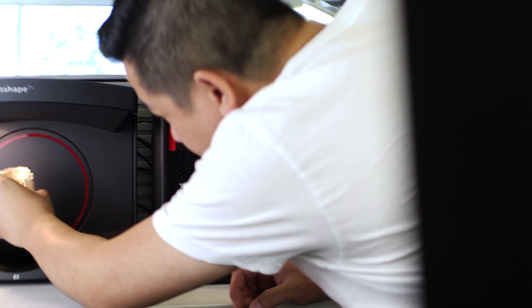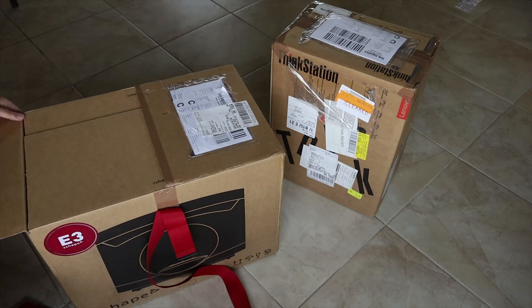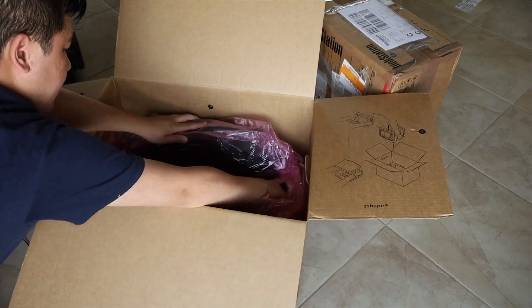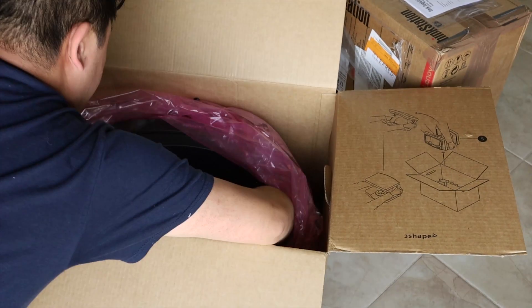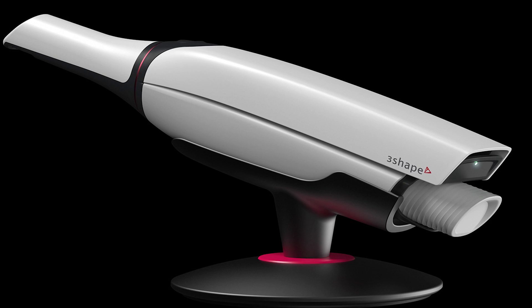The first question is what's new and what makes the Red Series so special? When I first opened up the box, the first thing that stands out immediately is the Red Ring, and that conveys a feeling of speed, kind of like a red sports car. It does bring the design of the latest series of desktop scanners in line with the red accents on their latest model Trio scanner.